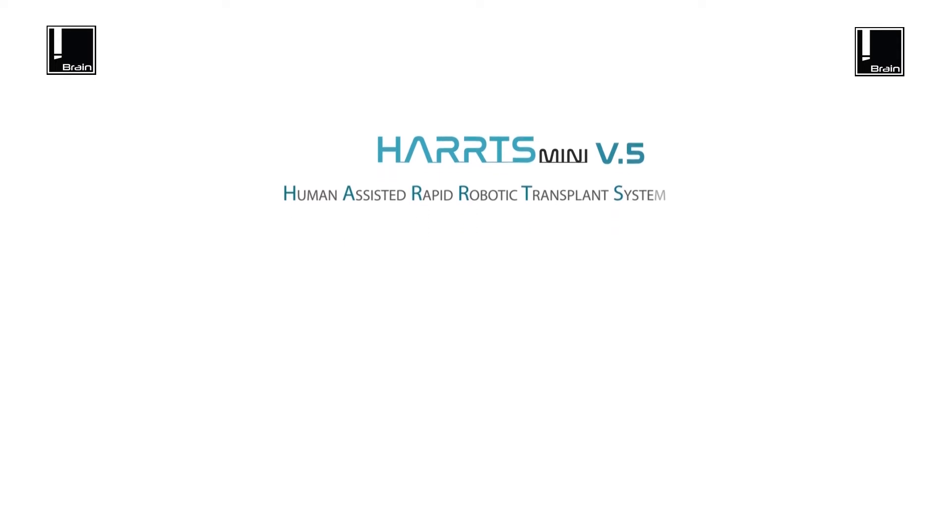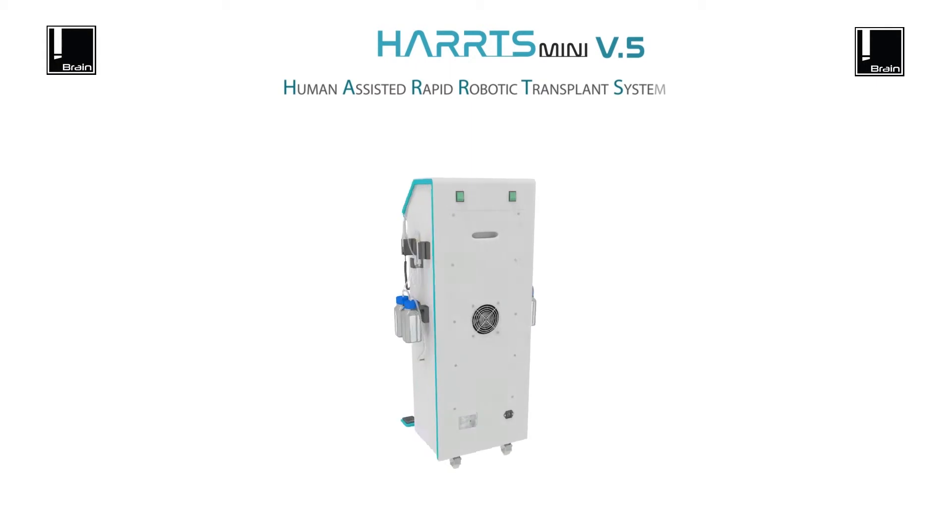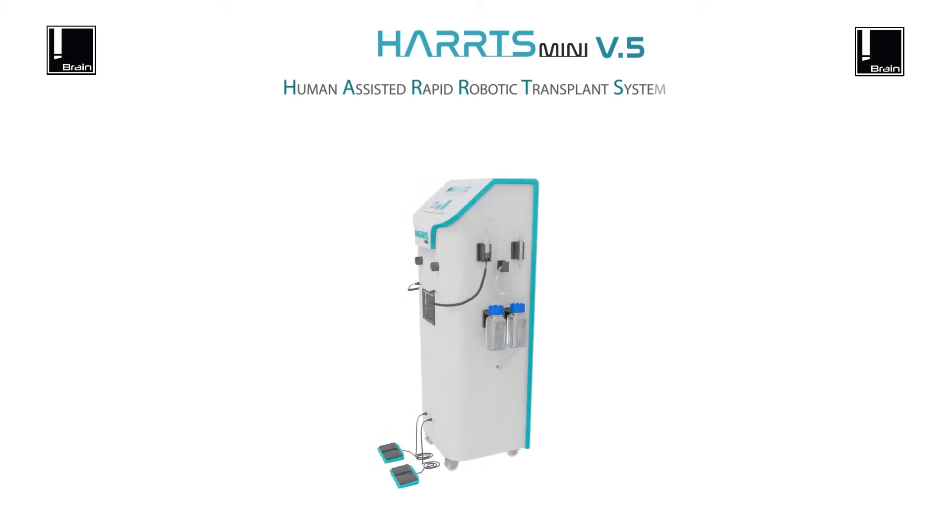Introducing HARRTS — Human Assisted Rapid Robotic Transplant System. Revolutionizing the way FUE hair transplants are done worldwide. Win your patients' hearts with the robotic touch.